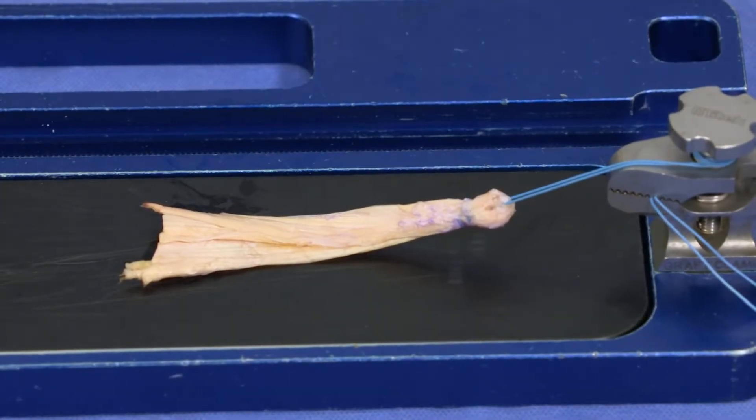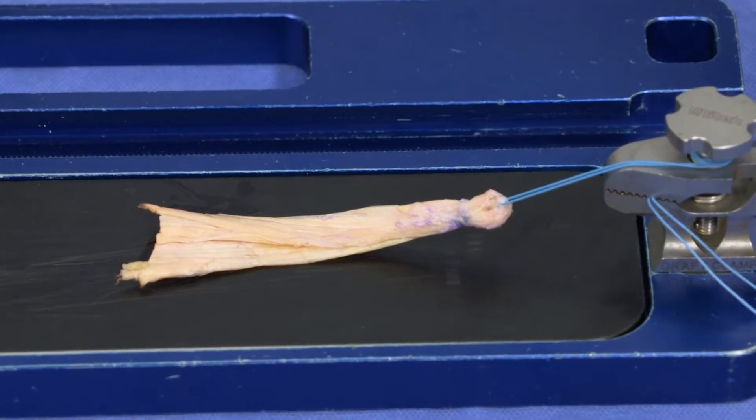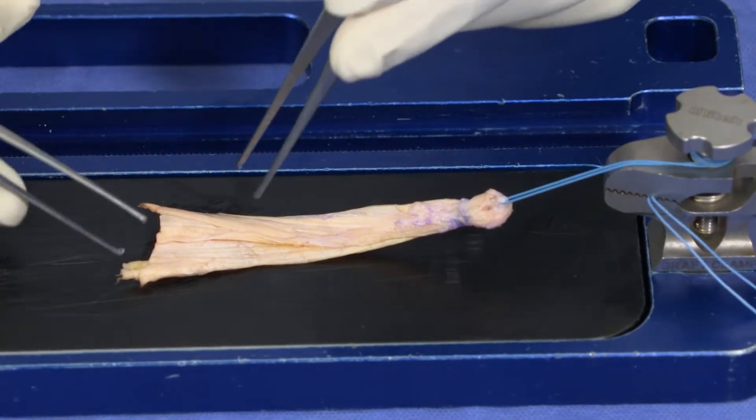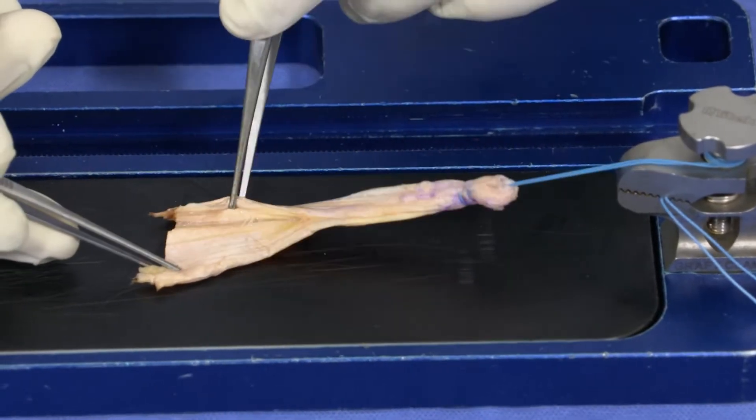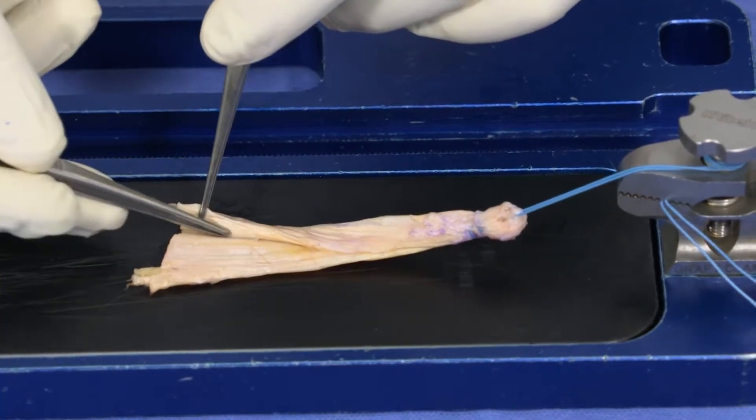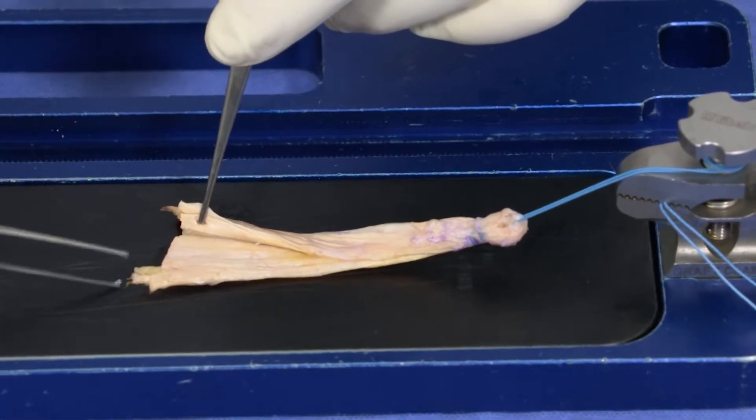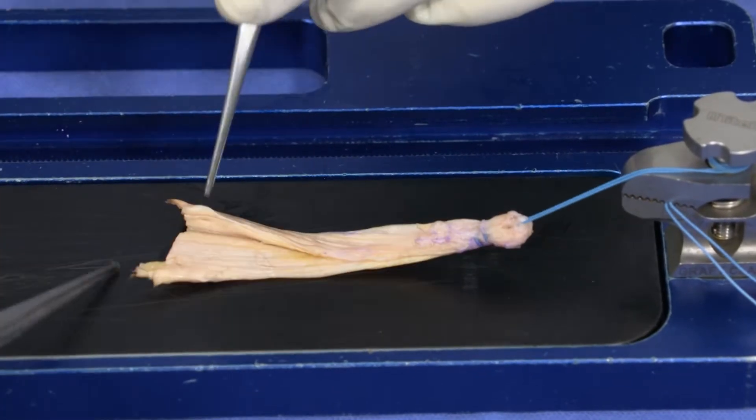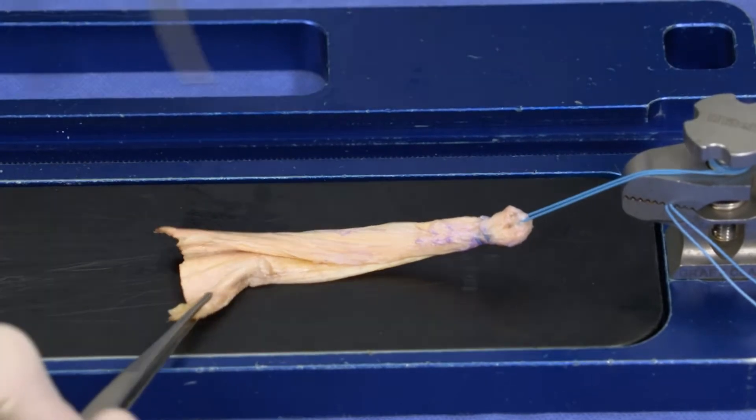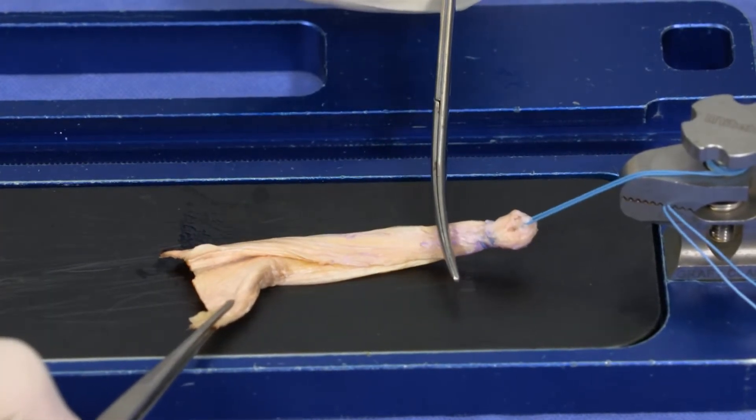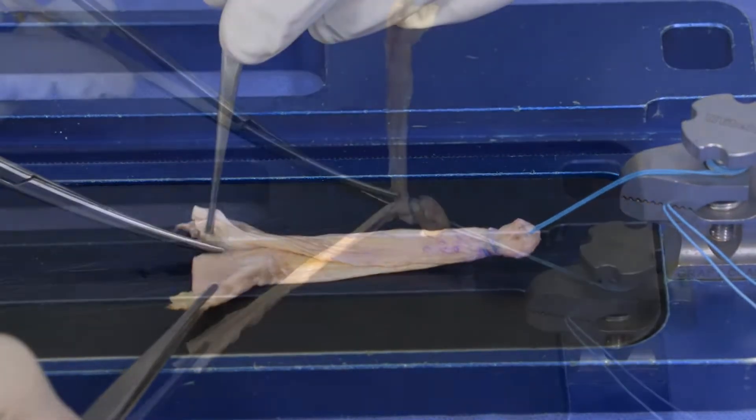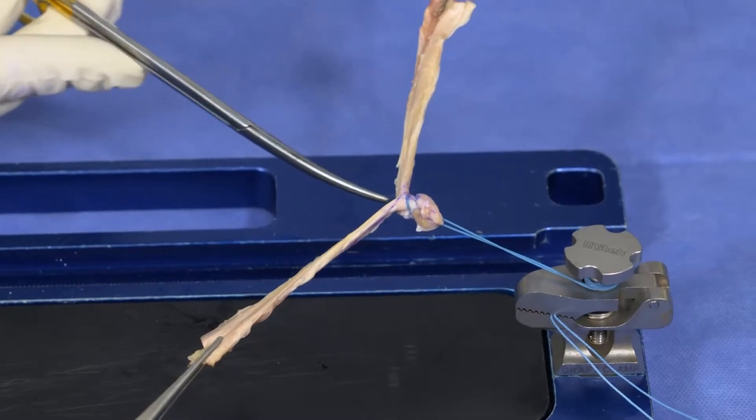Okay, so here's our tendon. We've measured it, and it's actually almost about 10 centimeters in this case, so it's a really long tendon. You can see the natural split here on the surface of the tendon between the intermedius and the rectus, a nice natural split right here. I'm going to have you hold that, and then we'll just split right down there, leaving about 10 to 15 millimeters here in the distal end that came off the patella. It looks perfect.